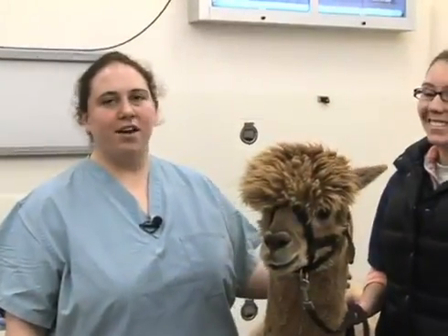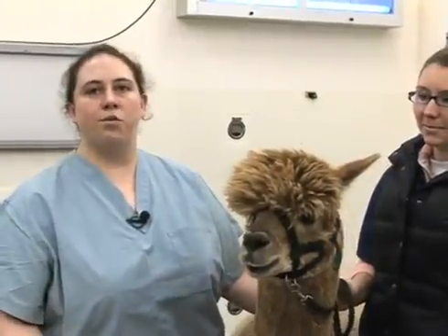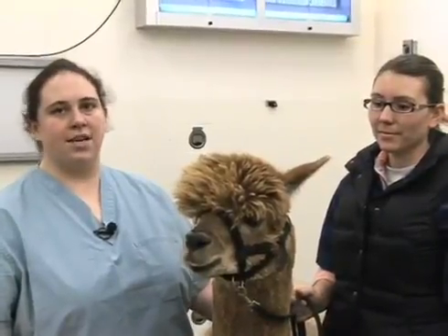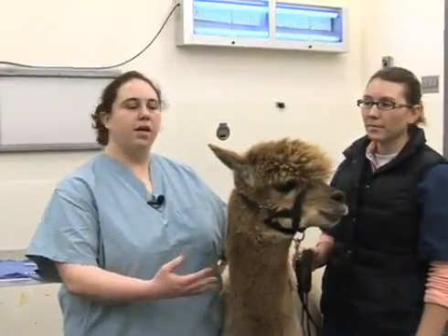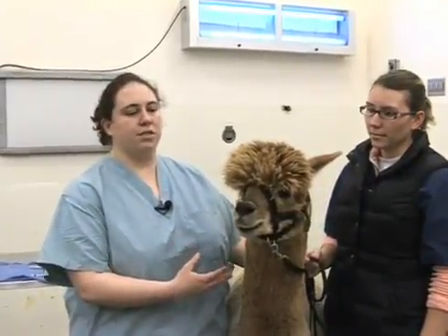Today we have Macchiato, and he's going to be our assistant to demonstrate the removal of fighting teeth. Most of the time when we think about removing fighting teeth, it's in males. However, females do occasionally get teeth of a size and curvature that necessitate removing them. We're going to perform this procedure in a standing animal that's not overly restrained, but if you have a chute available, that can be very helpful to prevent side-to-side movement and give you more control of the head.